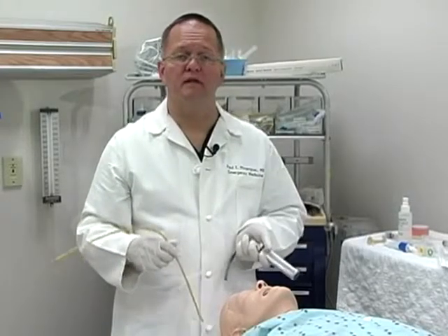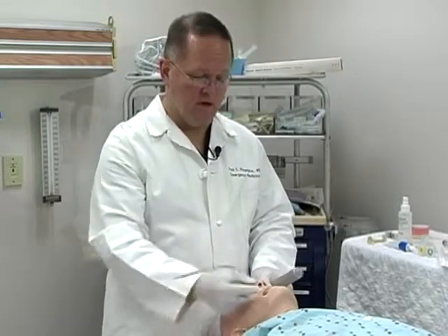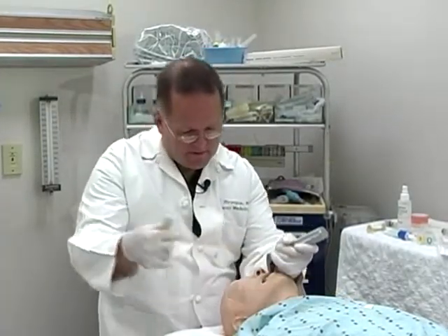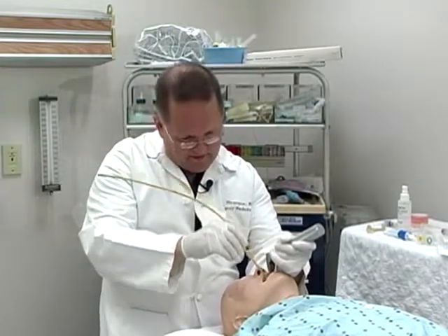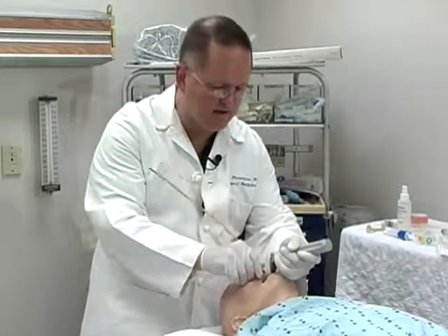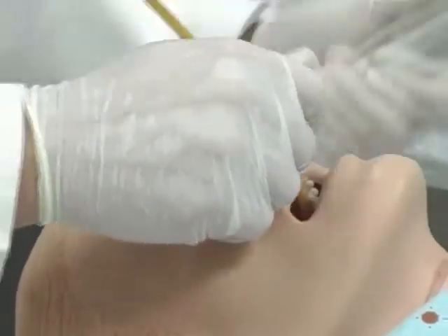The technique utilizes a standard laryngoscope and standard positioning. You open the mouth and try to obtain a view with the laryngoscope. Once you identify some landmarks, pass the gum bougie down along the roof of the epiglottis and you will feel it begin clicking on the tracheal rings as it is inserted in the trachea. If you do not feel the clicking of these tracheal rings, you are likely in the esophagus.